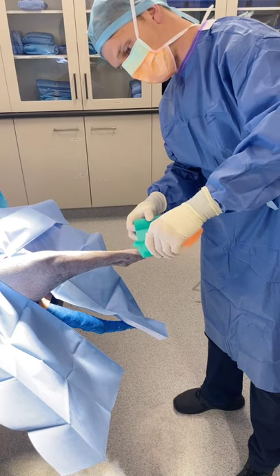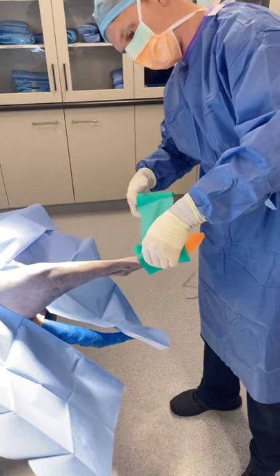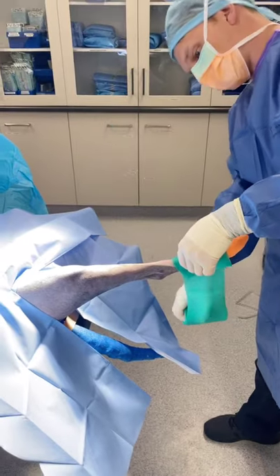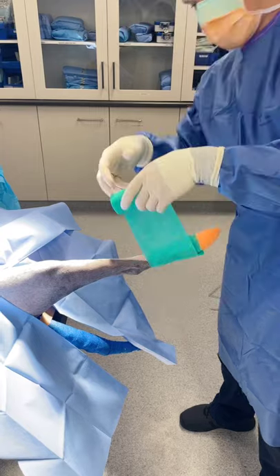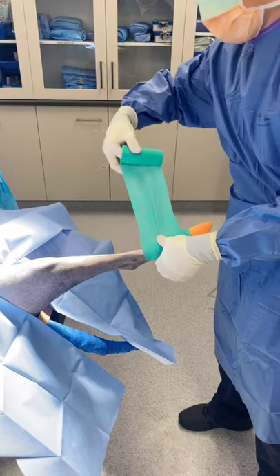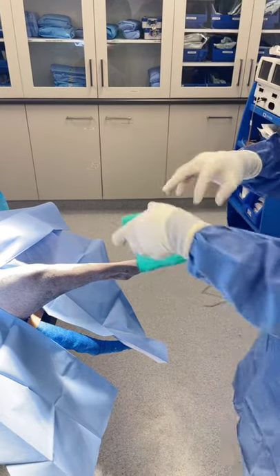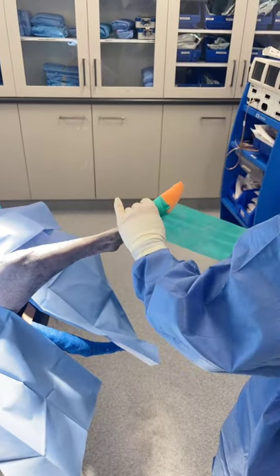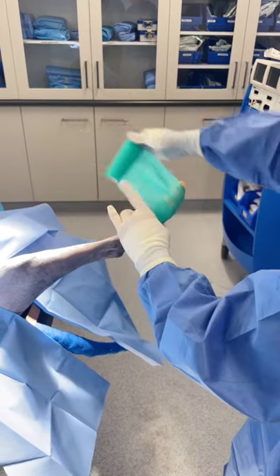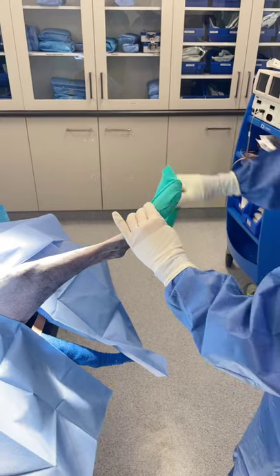We then have sterile vet wrap that we're going to wrap around the foot. With this foot preparation, we have a glove on the foot first, then non-sterile vet wrap as the next layer, and then once we're in surgery we do a sterile vet wrap over the top of that. Some people like to put a waterproof barrier there — I do that for hip replacements but don't stress about it too much for a TPLO. The glove itself serves as the waterproof barrier on the foot.